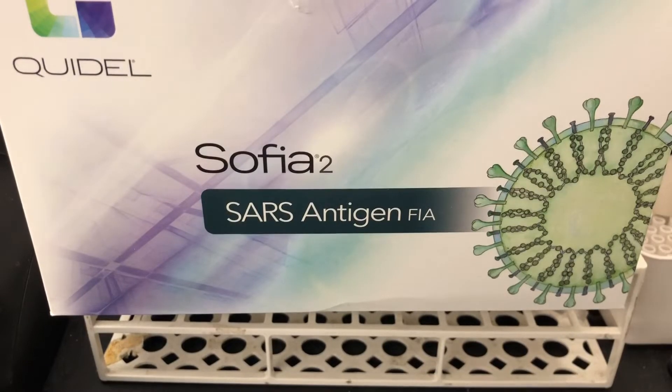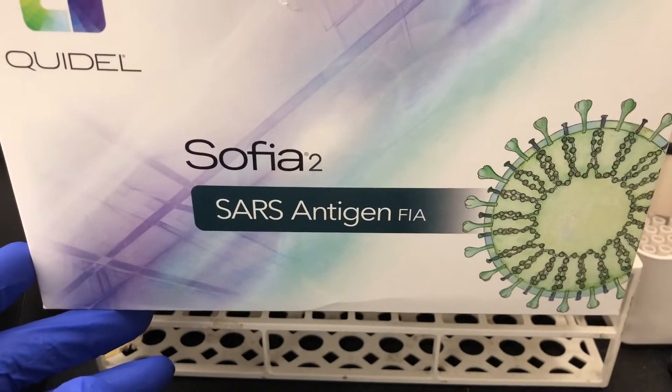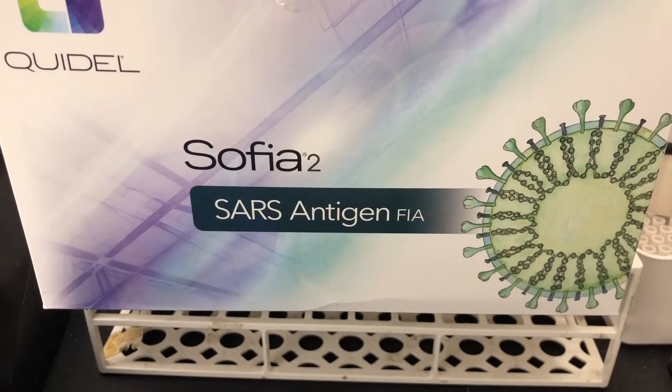In this video, I'm going to go over how to perform the SARS antigen test using the SOFIA-2. This is a qualitative detection of SARS rather than a PCR detection, like the various other analyzers I've gone over.